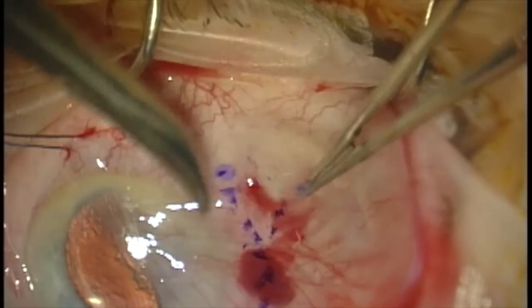We're going to infiltrate this area with 2% lidocaine with epinephrine. This helps to balloon up the pterygium from the sclera and make dissection easier.